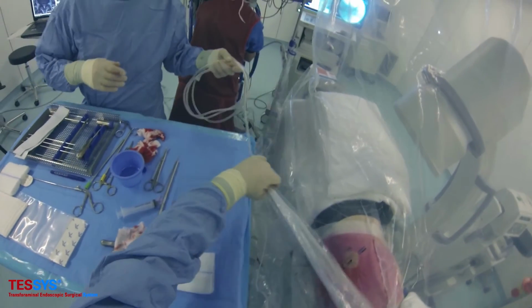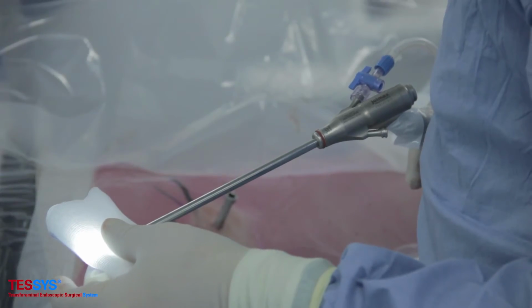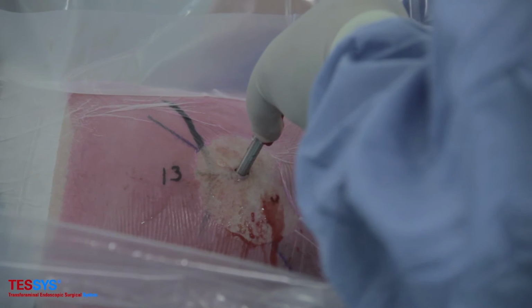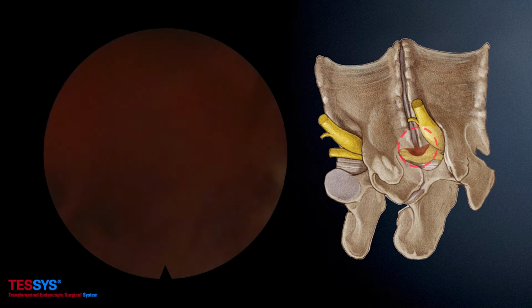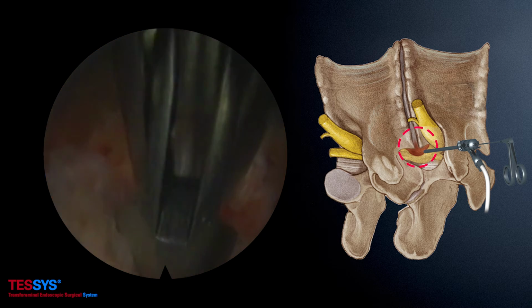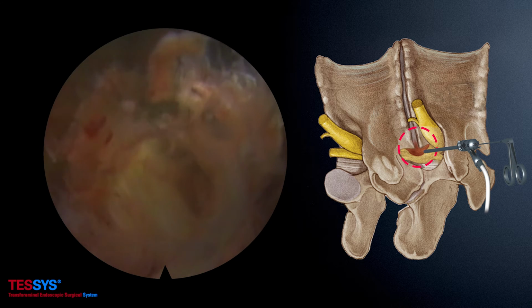The preparation of the foramenoscope and pump can be done now, including white balance of the scope and leveling of the pump. We see an overview of the foramen. The head is on the right side, the legs on the left. The disc and disc protrusion is in the direction at 12 o'clock, and the superior articular process is in the direction of 6 o'clock.